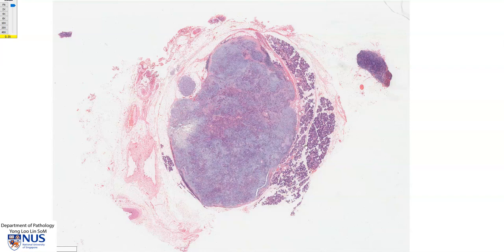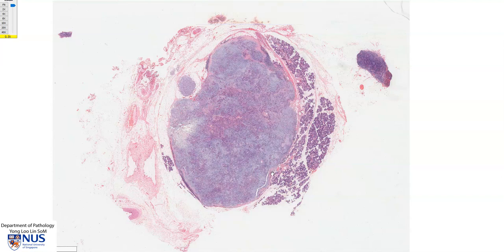Hello, this is a virtual microscopy slide of a pleomorphic adenoma of the parotid gland. I'm just going to outline the tumour here. This is a fairly well-demarcated tumour nodule. In some areas, for example near this inferior aspect, there is a fibrous capsule around it, but in other areas it's just well-demarcated.